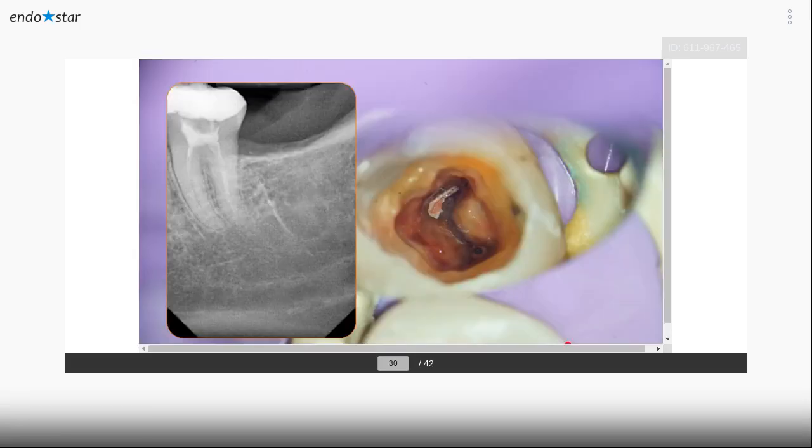Yeah, and let's go further. This tooth number 37 again, one more. I don't know how it is in your countries, but sometimes we can find very rare material. We call this Russian red, or in our country, resorcinol. So if you are working with this, first of all, you have to remove it by using ultrasonic, and then you can go with Reendo files.